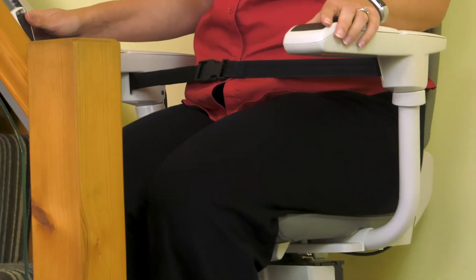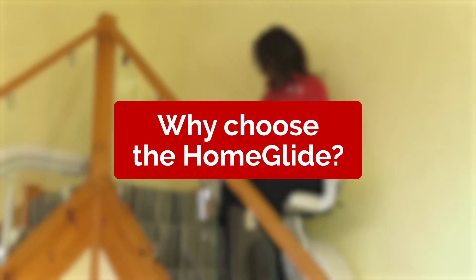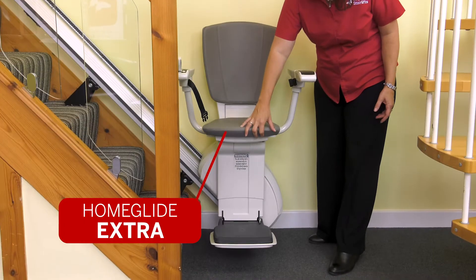We also have a stock of them ready to be installed in just a few hours. Why choose the Home Glide? The Home Glide is the basic sister model to the Home Glide Extra. Whilst the Extra model comes with a host of upgraded features, the Home Glide is more simplistic.